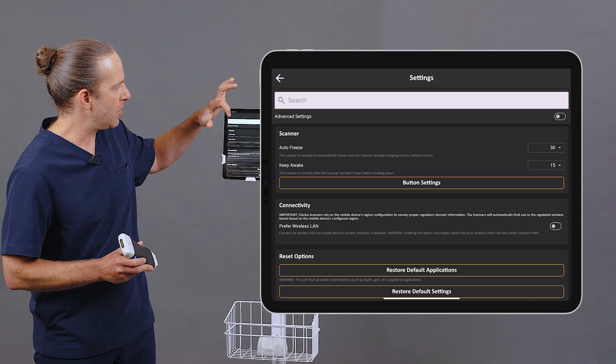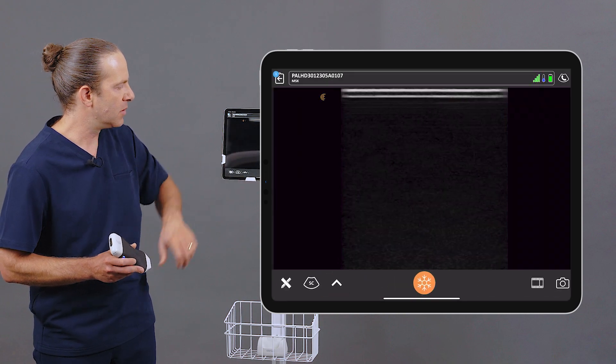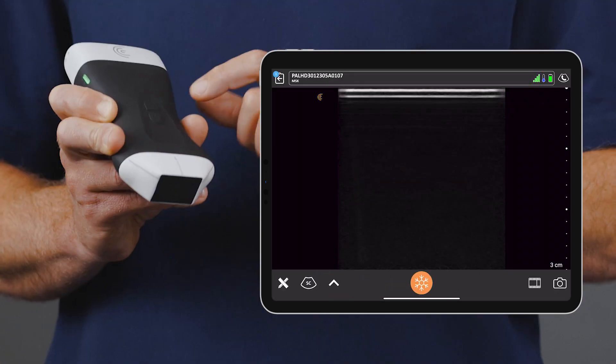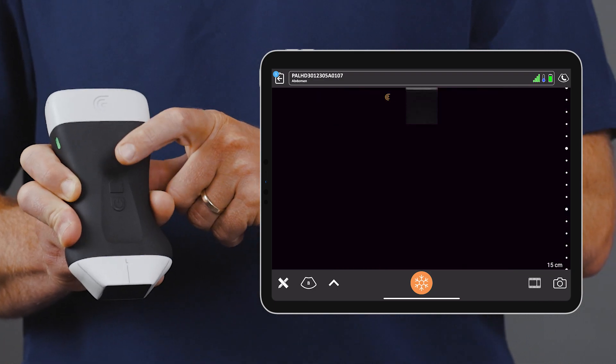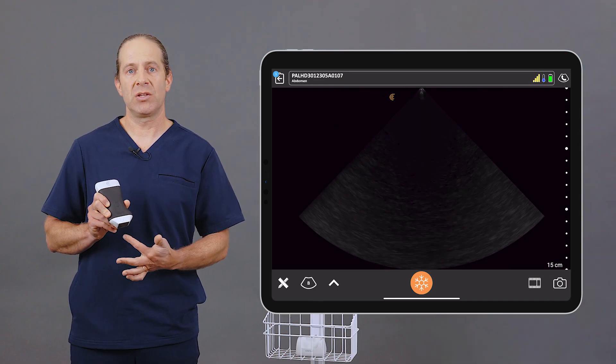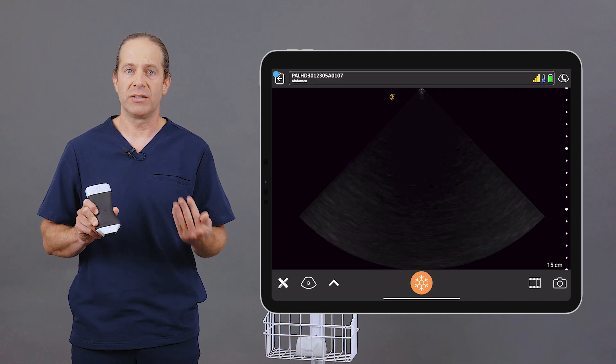Once I set that up and go back to Scanning, now my Button Up is set so that once I press it, it promptly switches between the two arrays with very little lag time or delay.